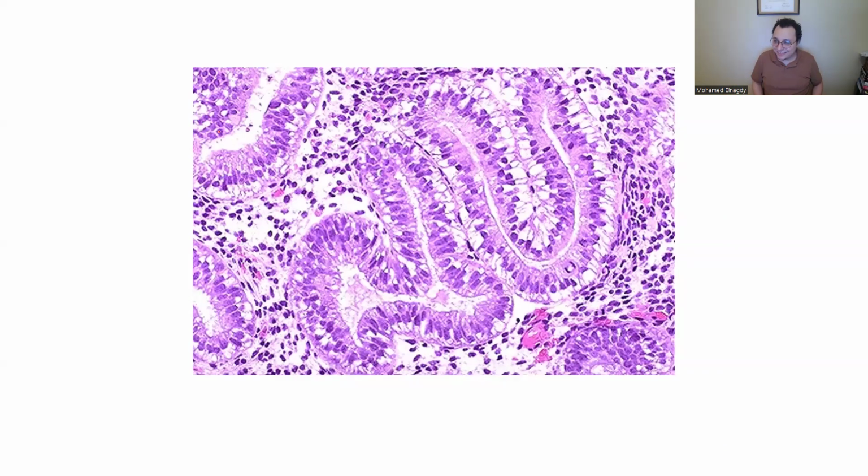Muhammad? This looks like secretory again. Yes, early secretory, subnuclear. I'm trying to go back and forth. Subnuclear, loose stroma.